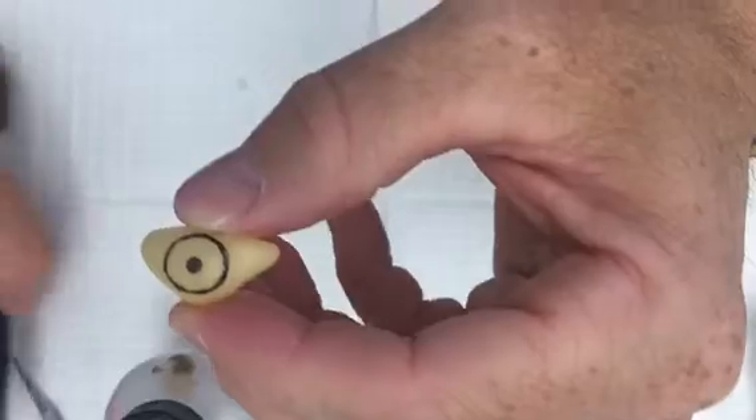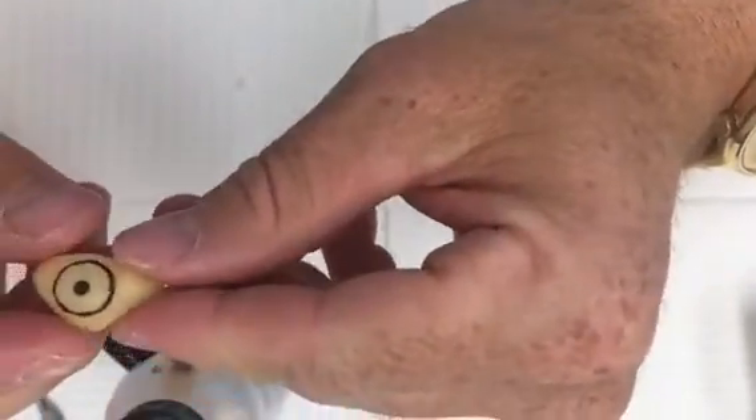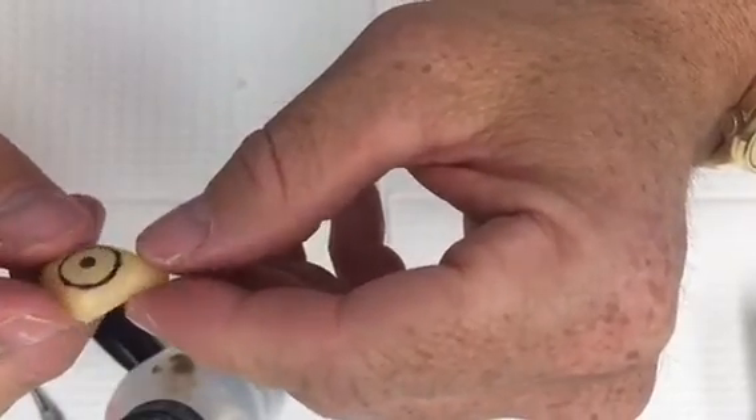Have them stand up and make sure that the gaze is straight with the other eye. When you get to this point, you can send it back to me and I can make the eye.